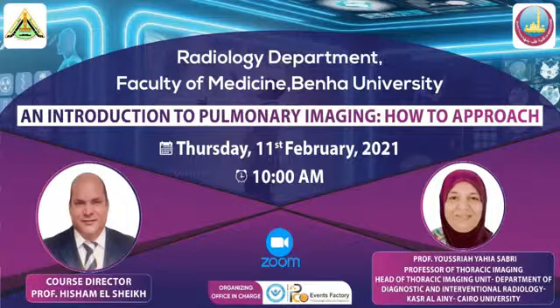لو مش باين، وده بيحصل بقى في السنترال ماس مع كولابسد، اللي هو لو ده اللي هو يقصده يعني لو انا عندي برونكوجينيك كارسينوما وجنبها كونسوليديشن او كولابس في اللنج، لو ده السؤال المقصود. ده طبعا central bronchogenic carcinoma is a mediastinal lesion by the way, it is not a lung lesion. بالمناسبة هي بتعمل lung changes. طيب نيجي بقى انا هفرق ازاي؟ مش هفرق بمنتهى البساطة.